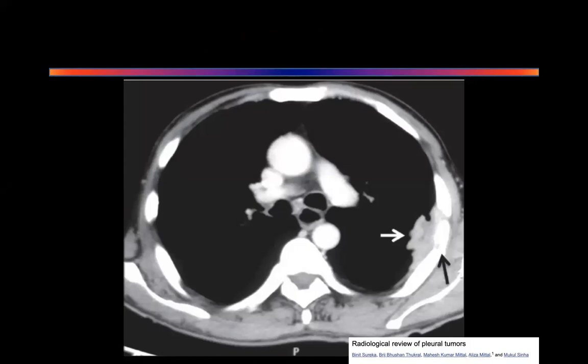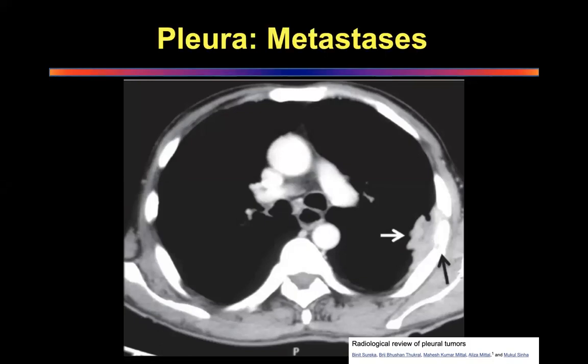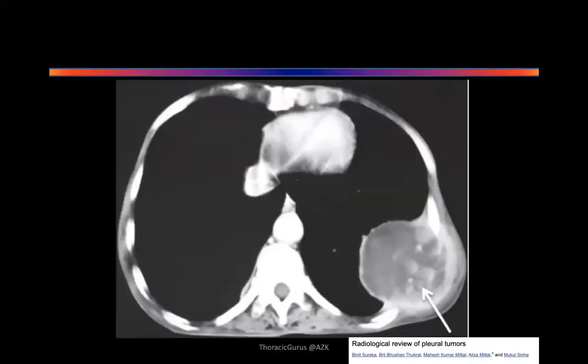This could be metastatic from outside the chest. You understand that? So the presence of a pathological fracture, everything else is acceptable. Osteogenic sarcoma, this, that. But don't forget to say this could be pleural metastasis. I'm specifically making a point here. Stay with me, Simran. Take the next one.